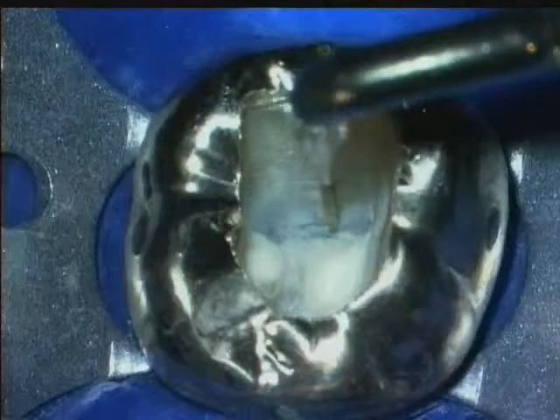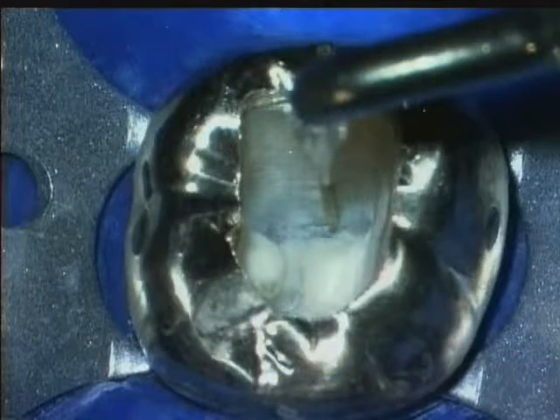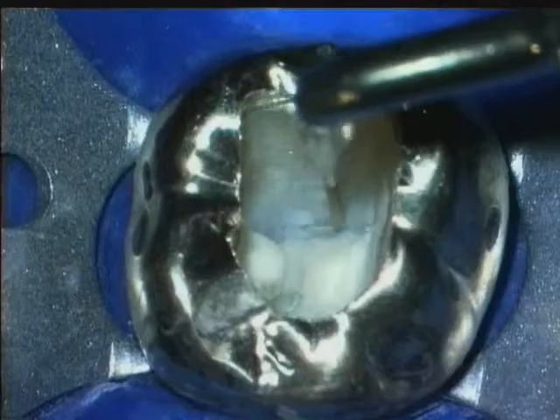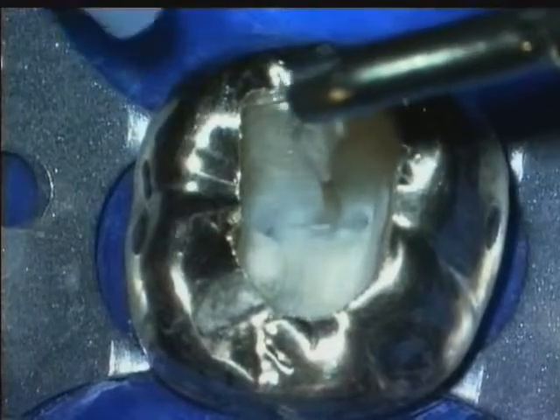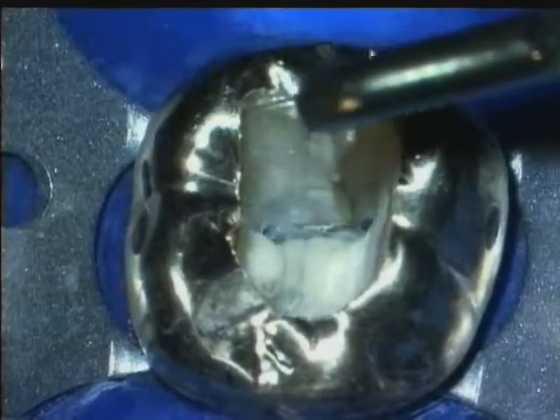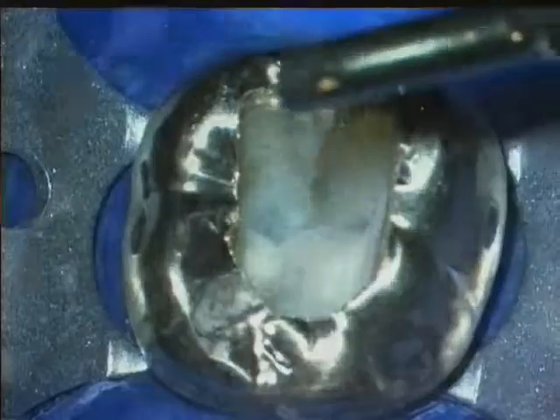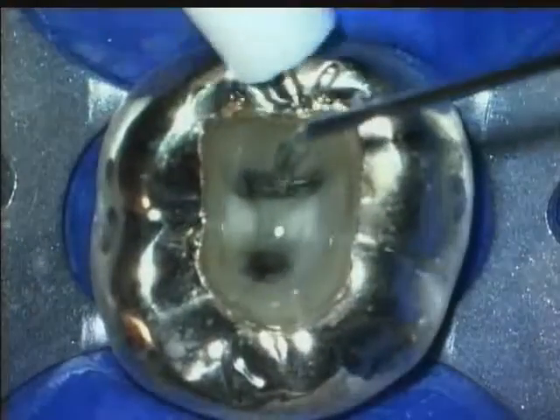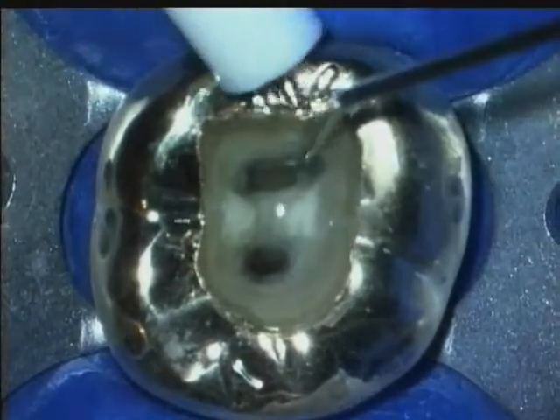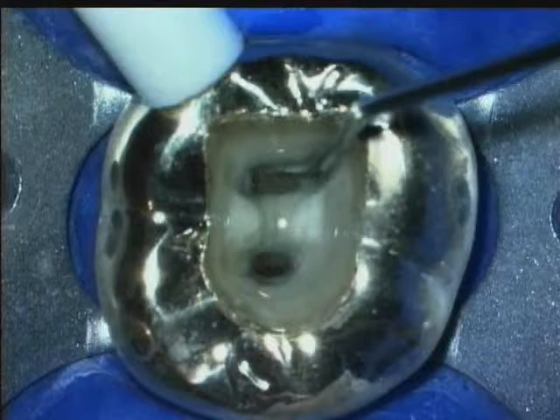In the second example, two canals are exposed. Troughing with Pro-Ultra Endo tip number 3 allows the access to be expanded safely. The ultrasonic energy gently peels away tooth structure to create straight-line access in this molar.